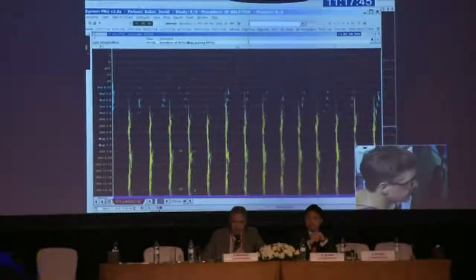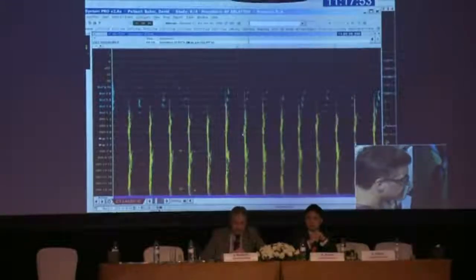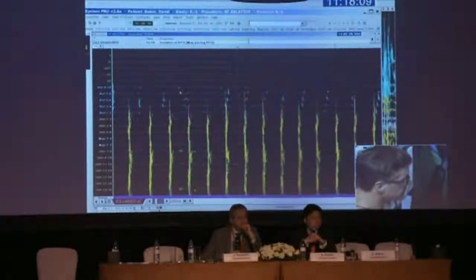And we can see that PV 5-6 is the earliest PV. When we were looking at the PV in the appendage, 5-6 was on the anterior aspect of the appendage. So I knew that whatever was fastest in that atrium had to be near the PV, on the anterior wall, not near the CS distal, and not near the CS proximal and the septum.